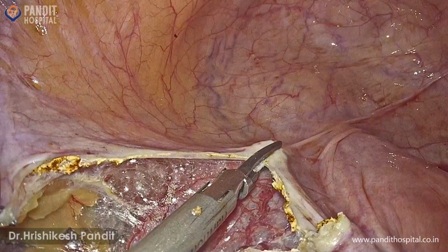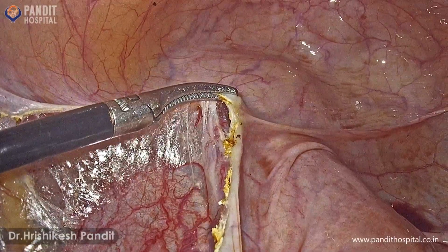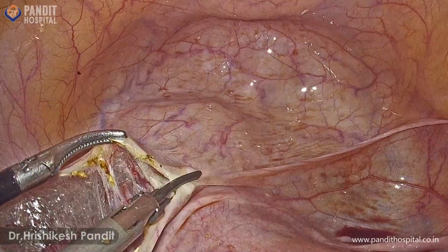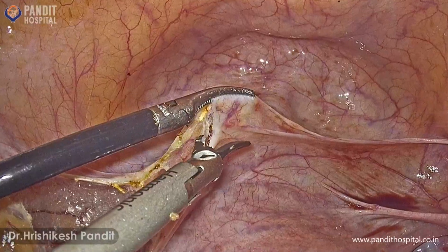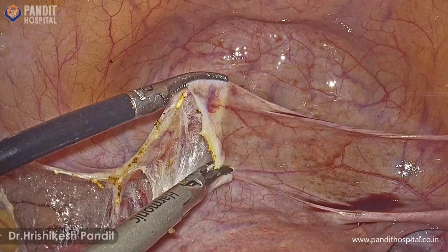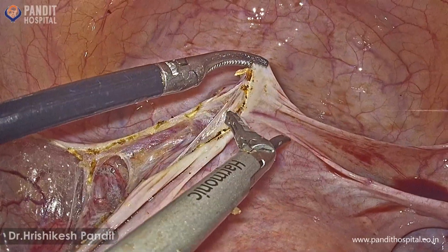First step, we start with bladder dissection. We are using a harmonic scalpel. Incision is made from left round ligament till the right round ligament. This is a crucial step in deciding the operability of the case. If dissection of the bladder can be performed smoothly, it indicates that it is not involved and therefore proves the case to be operable.